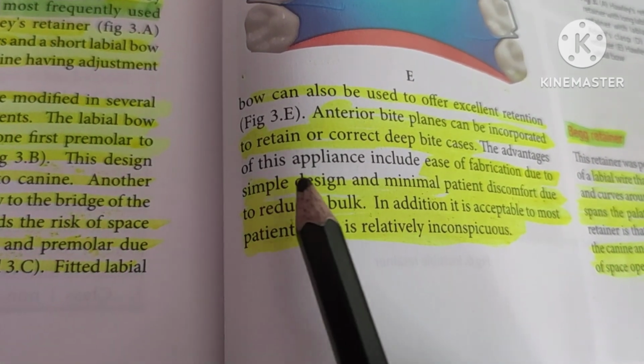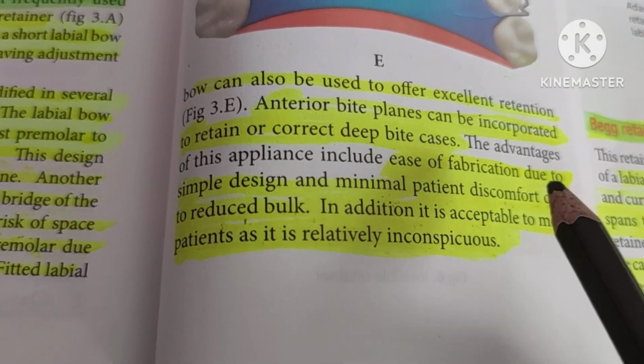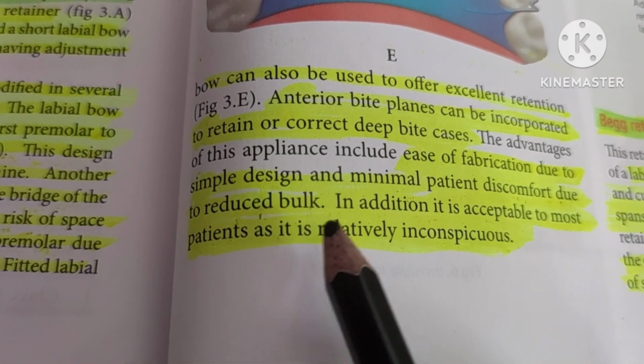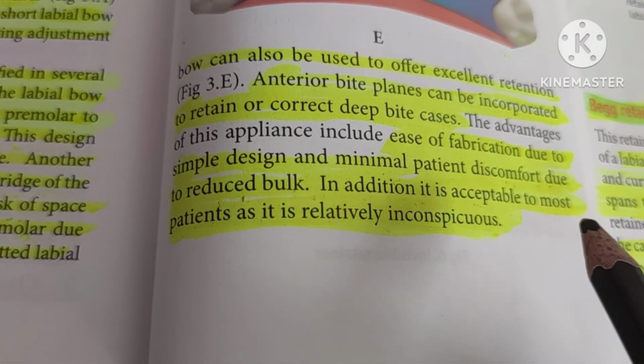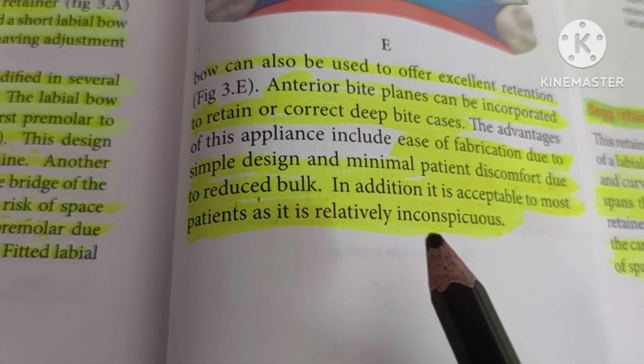The advantages of this appliance include ease of fabrication due to the simple design and minimal patient discomfort due to reduced bulk. In addition, it is acceptable to most patients as it is relatively inconspicuous, that is, unnoticeable.